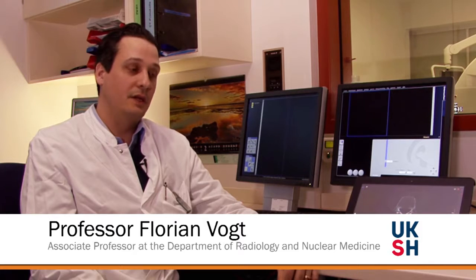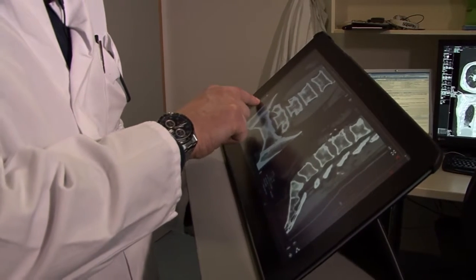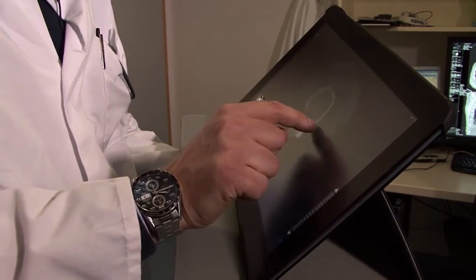We do believe that the devices that we use right now are inadequate because they do not provide all the opportunities that we need for professional reading. You can use these devices for on-call imaging and second opinion look, but you can also imagine to use these devices, for example, for bedside imaging on ward rounds or at the emergency department. And another option might be some remote assessment of imaging and remote peer review, for example. Portable devices will come and bring up a new exciting feature to the market because we need them definitely.